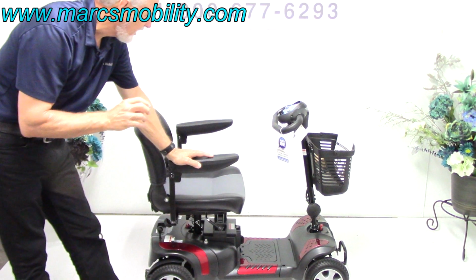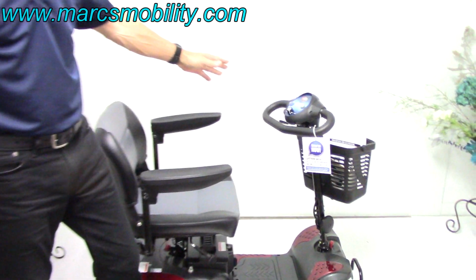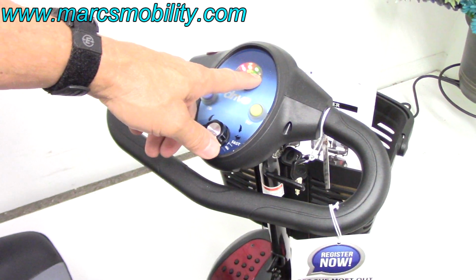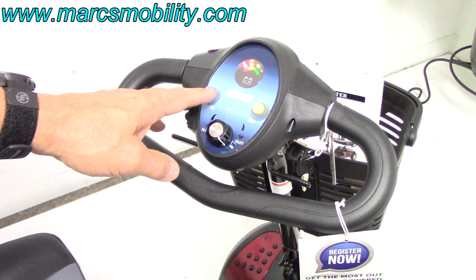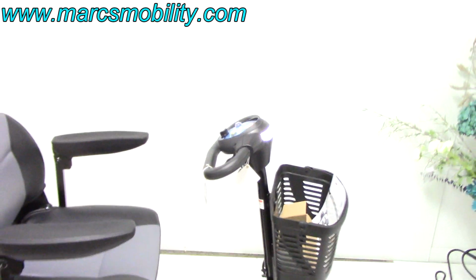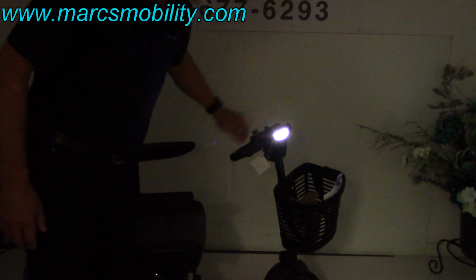But the first thing we're going to talk about is the tiller right here. This is called the tiller. Okay? On this tiller, you can see right here, you have your battery gauge. You can see the first light is off already. You lose your lights as you use the scooter, just like it tells you right there on the battery gauge. You also have headlights on here. So this is your headlight right here. You can see right up front, that's your headlight right there.